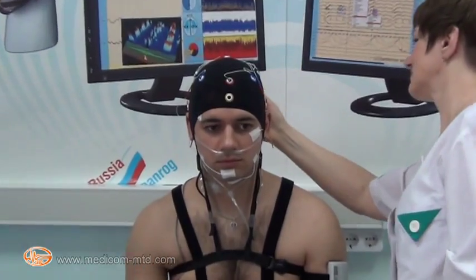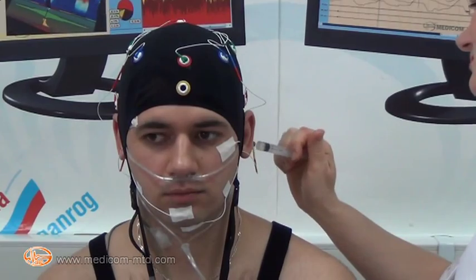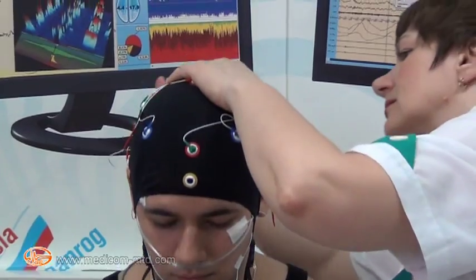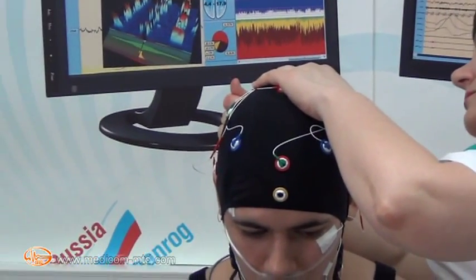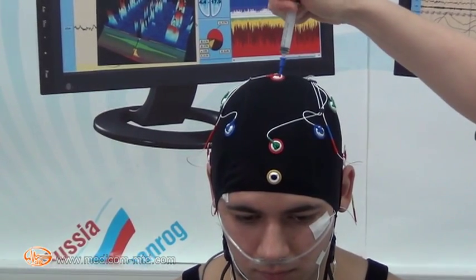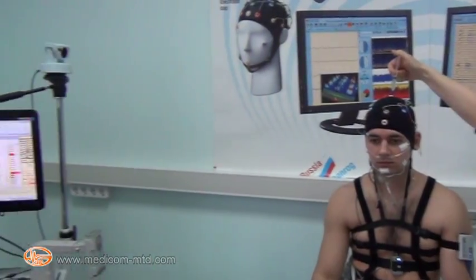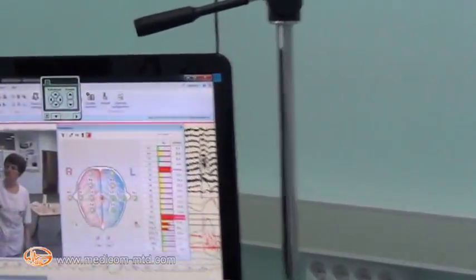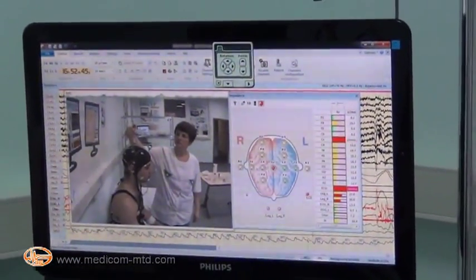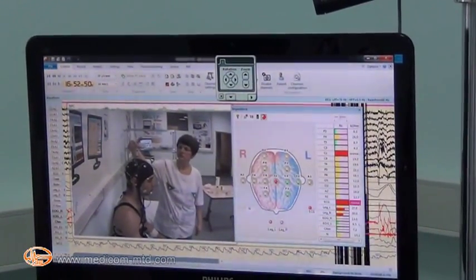The electrode set of Encephalan contains a fixing elastic cap with removable electrode system. Color markers of electrodes and electrode locks ensure simplicity of electrode attachment. Electrode locks are made of elastic material which increases patient comfort during continuous studies, especially during sleep. Using an injection syringe without a needle, insert gel into the slot of every electrode to ensure good quality contact with the head skin.